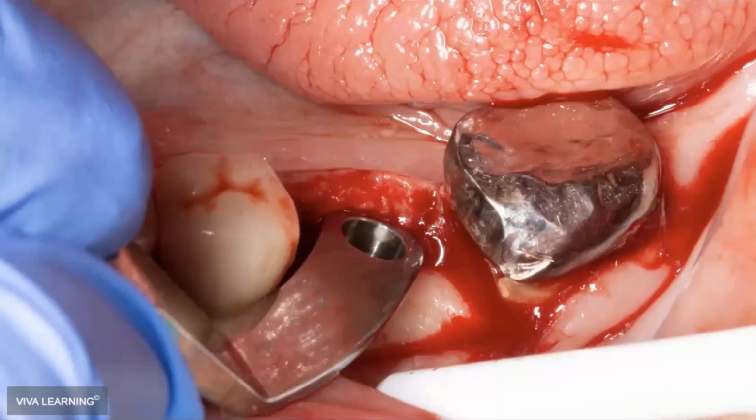One thing that I learned from using the laser, because I primarily used it to cut teeth, and so teeth preps are anywhere from like 2 millimeters deep to maybe 5 or 6 millimeters deep, and I've never really had any issues. But when I started trying to cut past 7 to 8 millimeters deep with the laser, I started encountering some slow cutting, and I attribute it to pooling in the prep. So you've got blood that's pooling in that osteotomy, and it becomes a little bit self-defeating because you're not really getting down to where the bone is. You're just ablating the blood before you get to the bone.